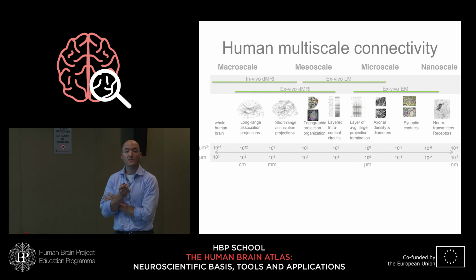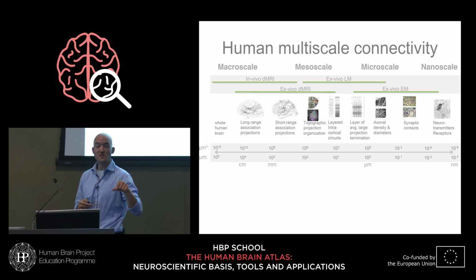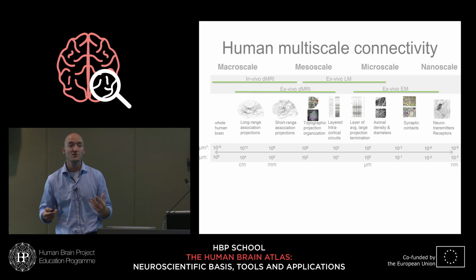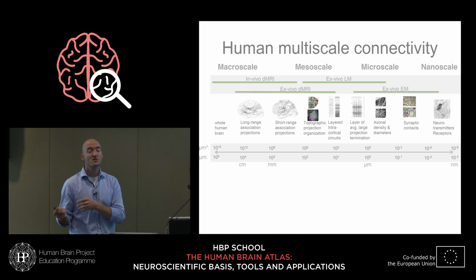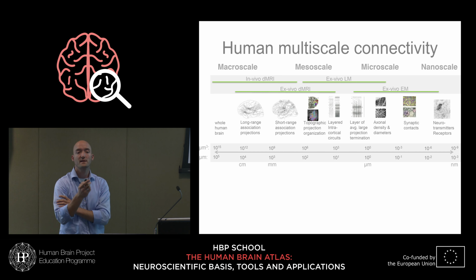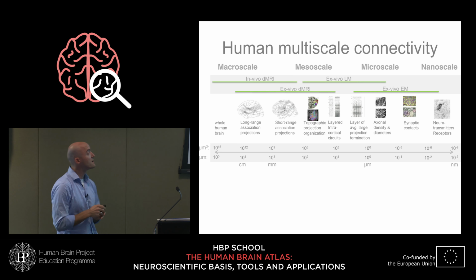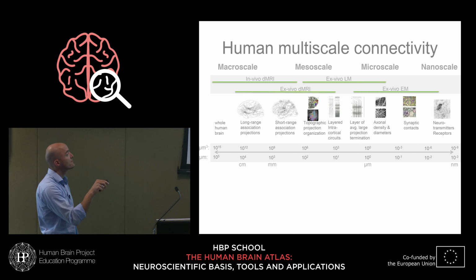And that's a lot of what human macroscale connectomics is about, such as being done not in the HBP but in the HCP, the Human Connectome Project, you might be familiar with that project as well. That main project, driven by the NIH in the United States, has actually just ended, and it's been followed up by the aging connectome, the baby connectome and the developing connectome. But the idea has always been to get in vivo as high resolution diffusion MRI as you could get in order to do what is called tractography. If you're not familiar with that term, I'll define it a bit better later. But it is a way to define and get a handle on those long-range white matter projections and map them out over the human cortex. So that you have access to with human diffusion-weighted MRI.